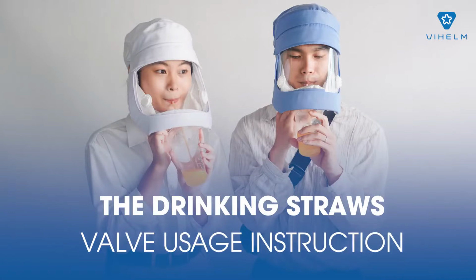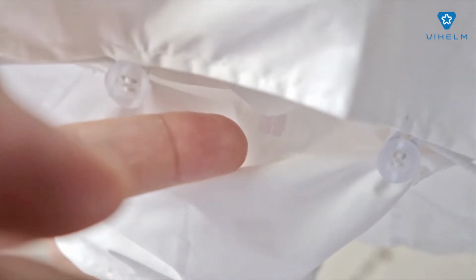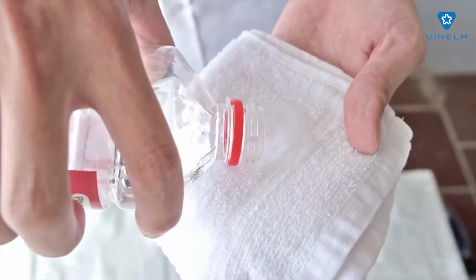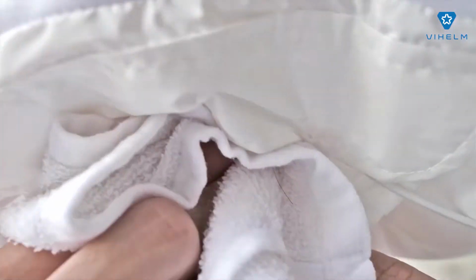The drinking straws valve usage instruction. During the usage of Vihood, if you want to use drinking straws, please follow these steps. Step 1. Use a soft towel with alcohol to clean the drinking straws valve.